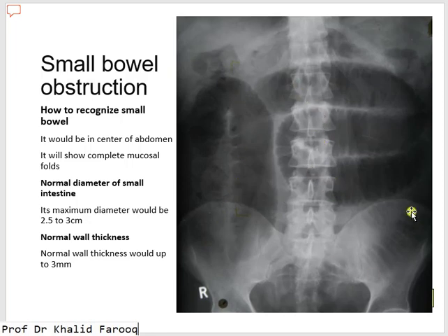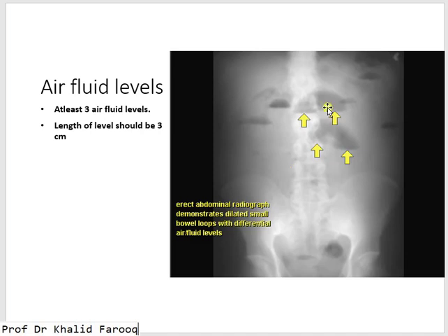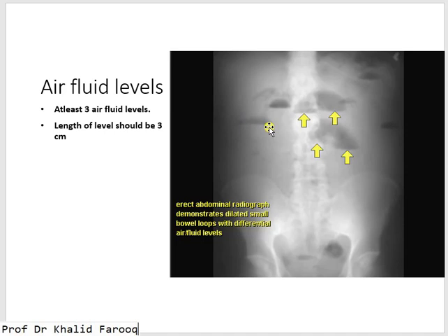On an X-ray of the abdomen in the standing posture, we can see multiple air-fluid levels suggesting obstruction. The criteria state there should be three or more air-fluid levels, and when we measure the length of one level it should be around 3 centimeters. So in standing posture, we will see multiple air-fluid levels. Another example also shows multiple air-fluid levels suggesting obstruction.